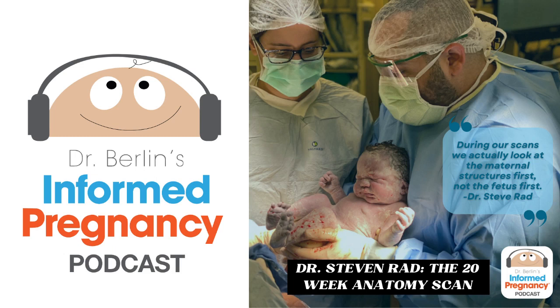Some centers will start with the vaginal ultrasound and look at your cervix length first. Some places do the vaginal ultrasound at the end, and some places will just look at your cervix abdominally. That's typically the first place everyone looks. What are you looking for at the cervix at 20 weeks? We want to make sure that the cervix is long, so there are no signs of cervical shortening or early labor.